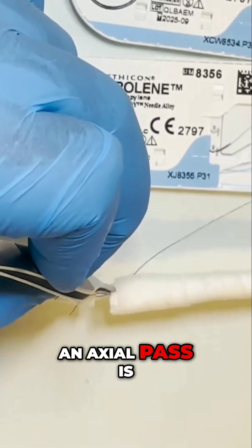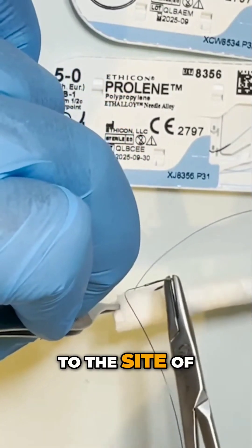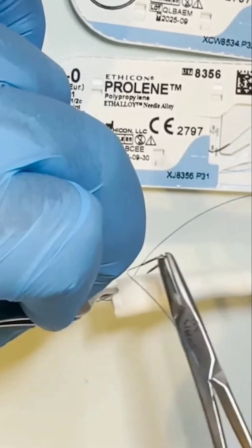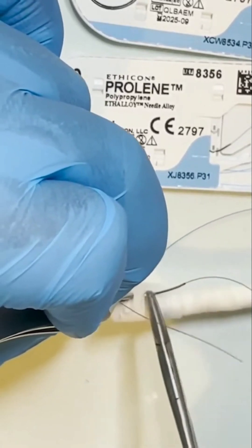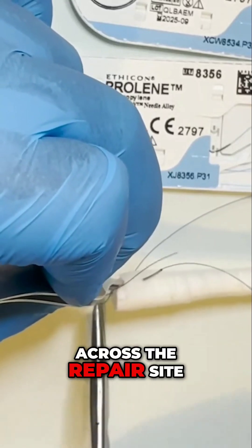An axial pass is again taken, this time starting proximal to the site of tendon division, across the repair site.